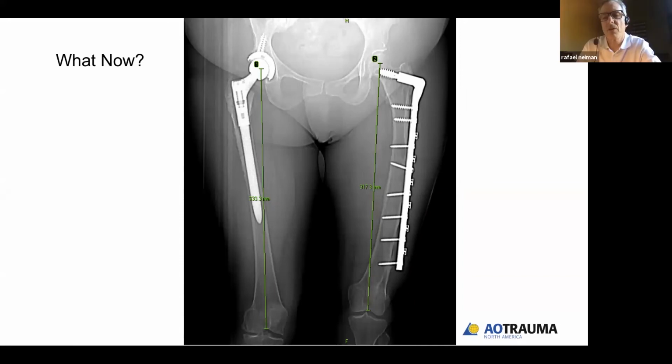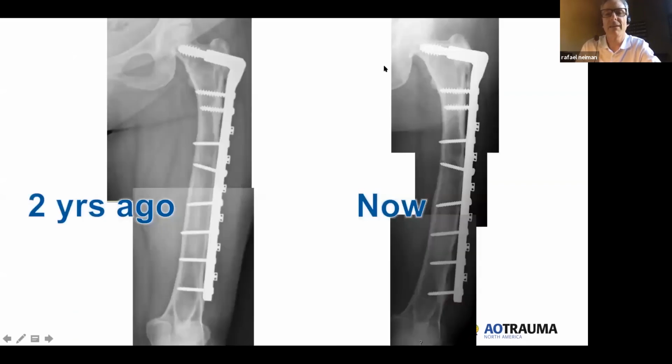Well, with this fibrous dysplasia, I wanted to see how big these lesions were. Did they erode all the way through the cortex in some places? If I'm going to be planning some osteotomy like a clamshell, is there a different longitudinal axis that I choose rather than just the mid sagittal? The other thing I wanted to know was what was going on in this head, with this implant up here. How loose was it? And was I going to have to do any countermeasures for that?